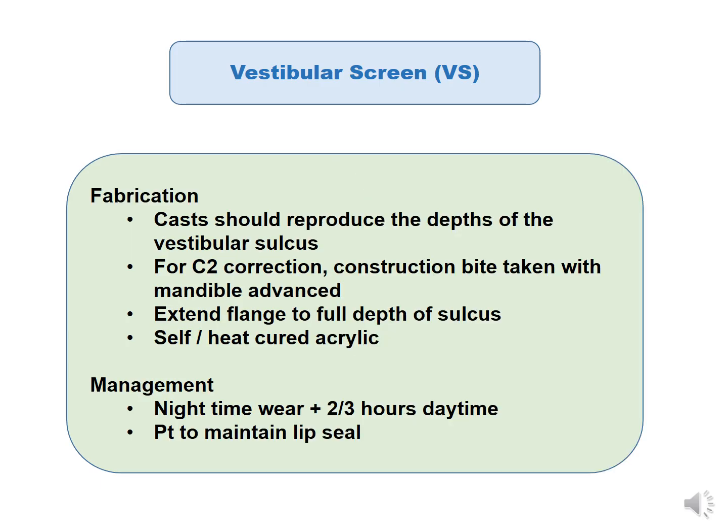Now, to fabricate the vestibular screen, the cast should reproduce the depths of the vestibular sulcus. For class 2 correction, the construction bite is taken with the mandible in an advanced position.